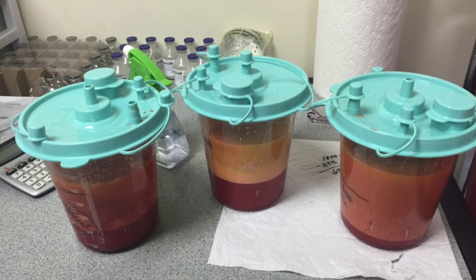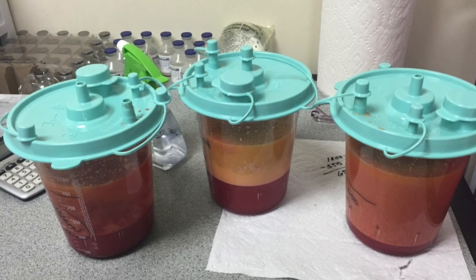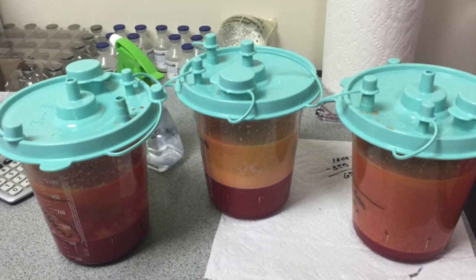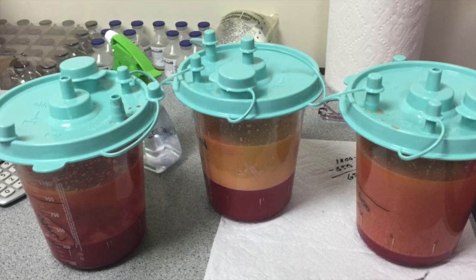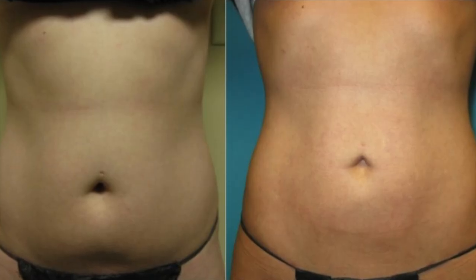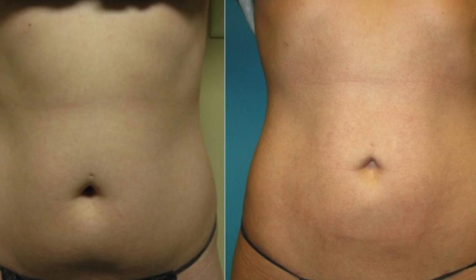This is the fat that was suctioned from Nikki's abdomen and sides. It is about 2.5 liters of fat and the rest about 500 cc's of bloodstained fluid that was initially infused into her abdomen before melting the fat. These are her before and 3 months after pictures after Vaser liposuction.